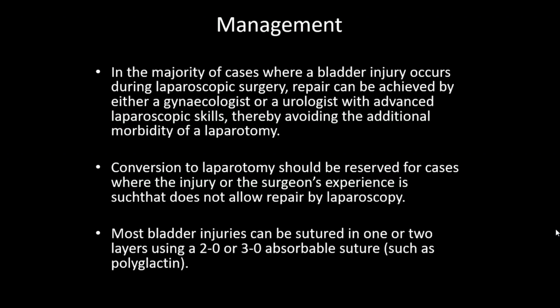Let's start from down below upwards. What about retrograde cystourethrography? Cystourethrography is done by injecting a dye through the urethra into the bladder and then taking an image.